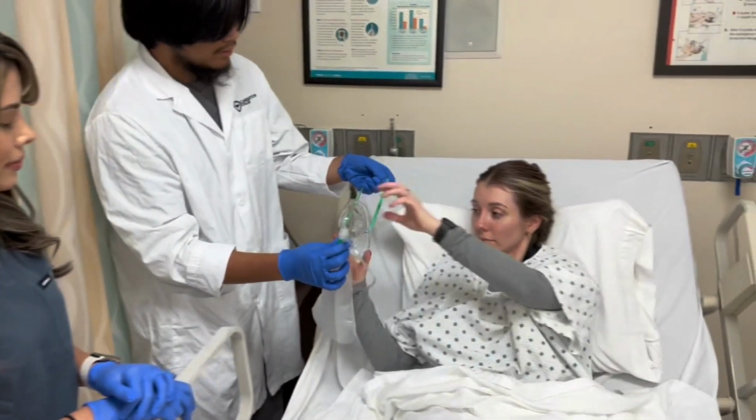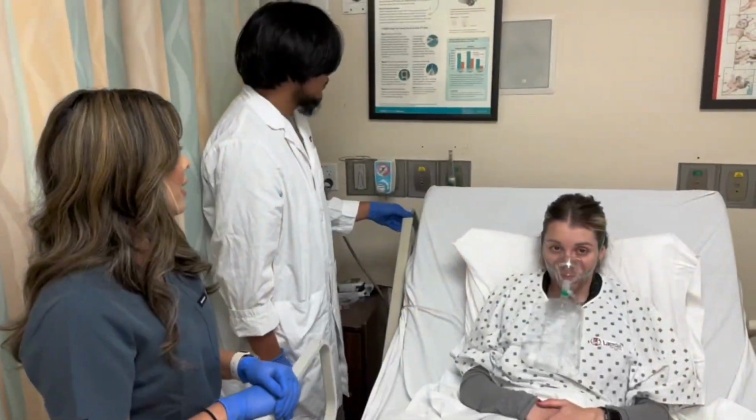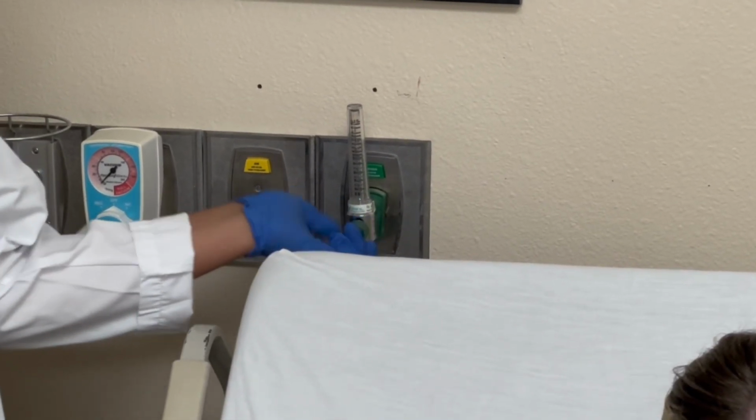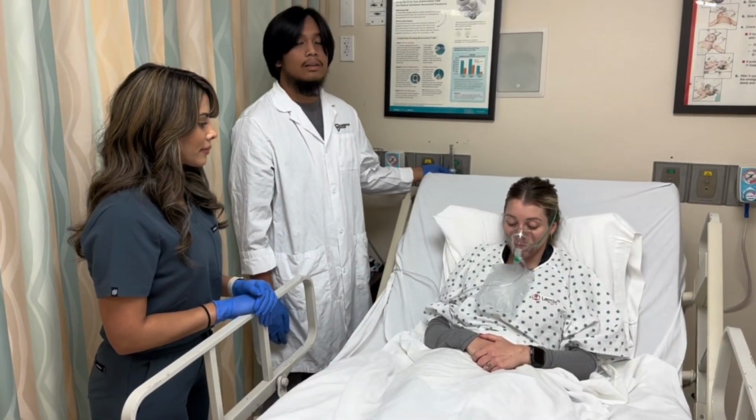Help you put this on? Flow rate at 15, just to flush it out. We're going to use this to inflate the bag, and once the bag is fully inflated, we're going to turn it down to 10 because that is what the physician ordered.